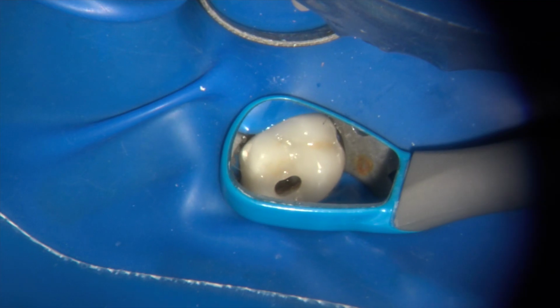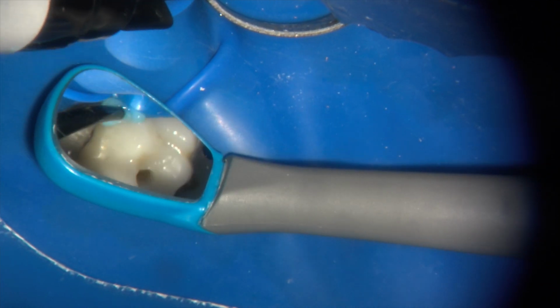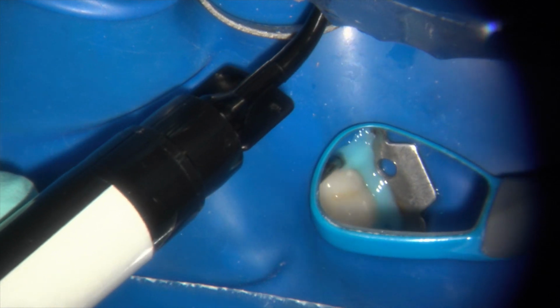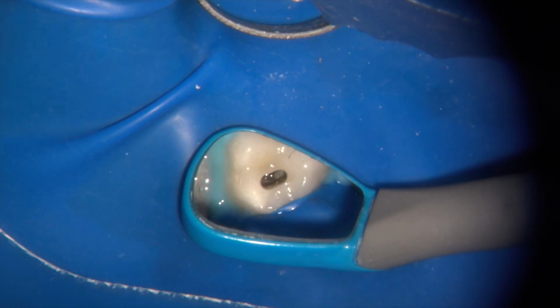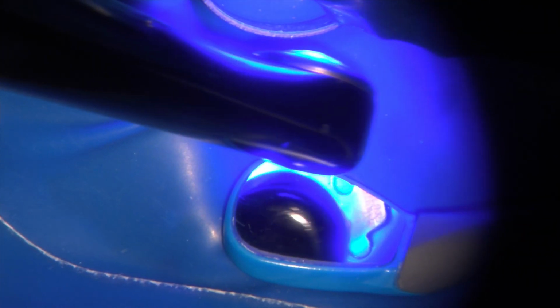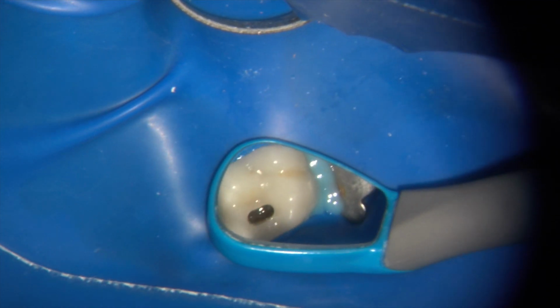So in this particular case, as you saw, what I have done is I have accessed through the crown only over the mesiobuccal root. And what we do in these types of cases is after we've accessed and found the canals, the MB1, and then searching through this small little hole. And this obviously can only be done if you're utilizing a microscope because it's such a small space and you need to really be able to see the floor of the chamber. Use your triangulation from your MB1 in order to find your MB2.